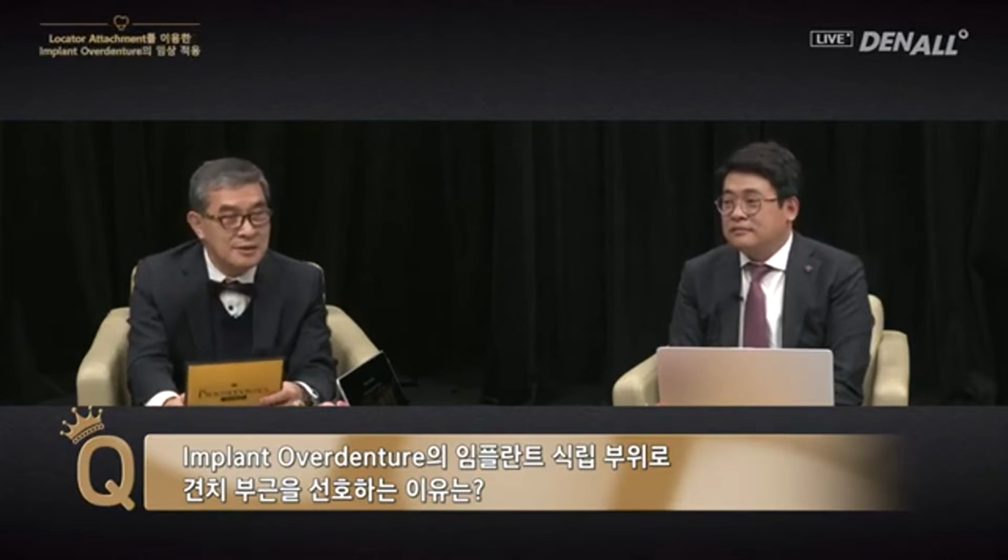When I taught in college, I brought in students in their 3rd year in dental school and did perio tests from tooth number 1 to 7, both in the upper and lower, and the result was that the Periotest value was the best in canine. When we just think about it, canine is a single root tooth. On the other hand, number 4 and number 6 have 3 roots. How come canine has better results?